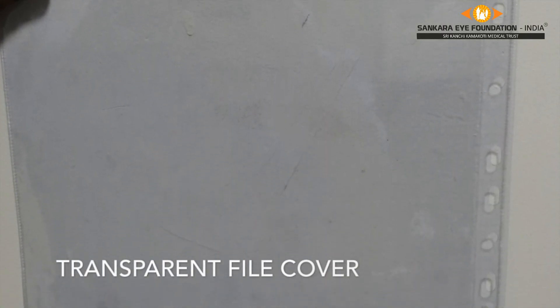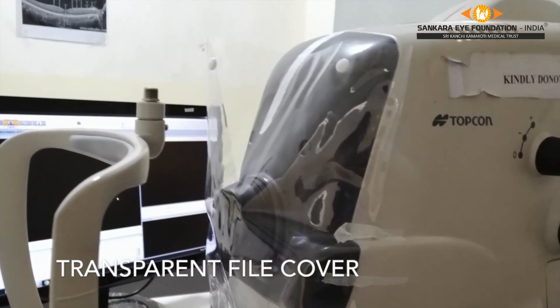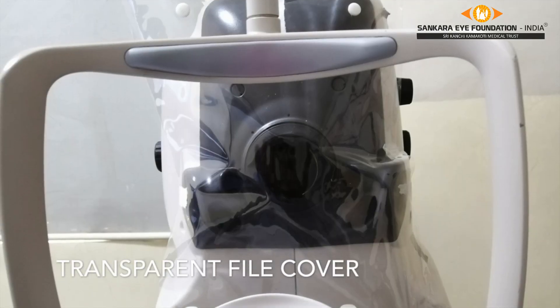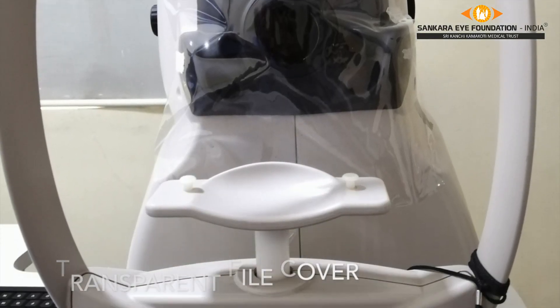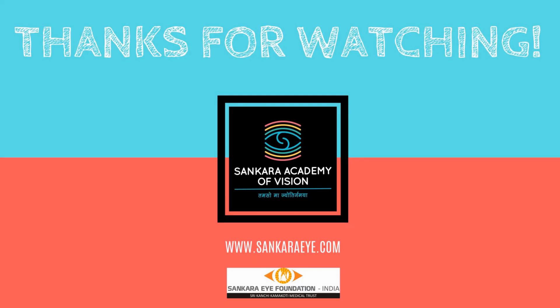Another modification to this technique is the use of a transparent file cover, which can be attached with the help of adhesive tape to the front of the machine. It can be cleaned in a similar way to what was demonstrated earlier. We hope you found the video informative and useful. Thank you.